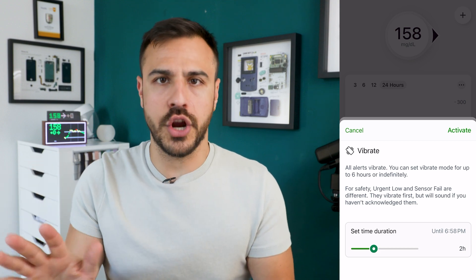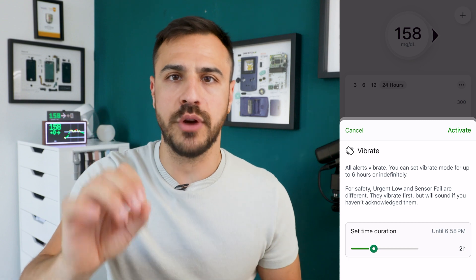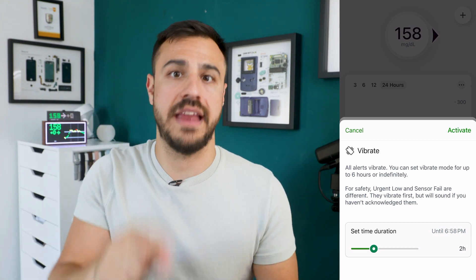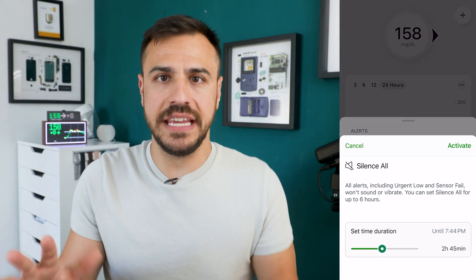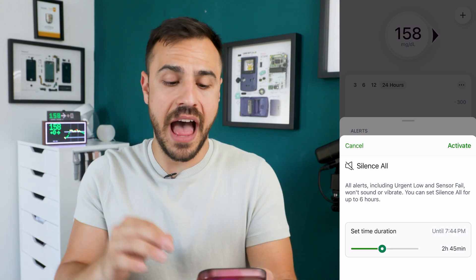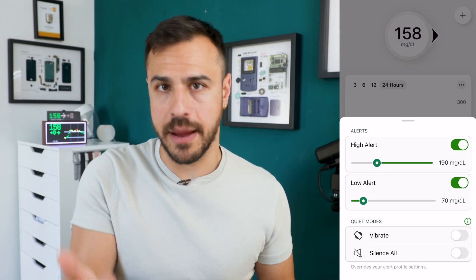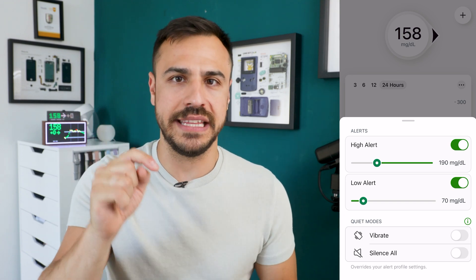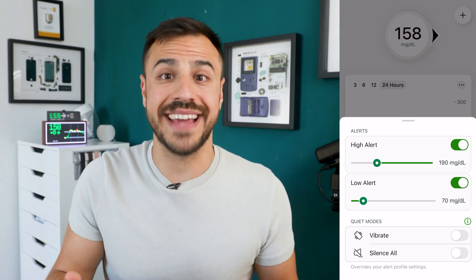So all of your alerts are going to vibrate, but the only two exceptions — urgent low and sensor failure — these will vibrate first, but if you don't acknowledge the alert, they will then make a sound. Then you've got silence, which works a little bit differently. This will silence all alerts for up to six hours. I personally don't really use the silence feature — I tend to use vibrate mode. Let me know if you're using silence all in the comments.